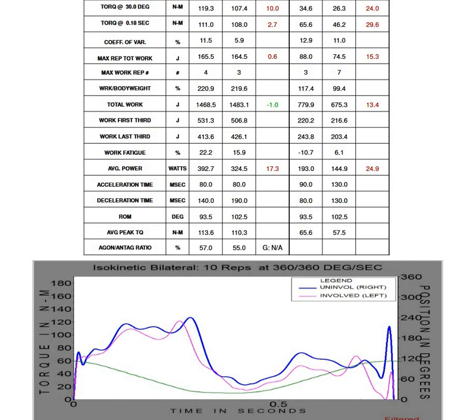Okay, so just to round off this series of videos on how to interpret an isokinetic report, we're going to finish with what, for my money at least, are the three least frequently found metrics within the published literature. The first being range of motion, obviously. It's not something that we're going to study. Doesn't mean it doesn't have some value, but it's not something that's going to be published within the literature.